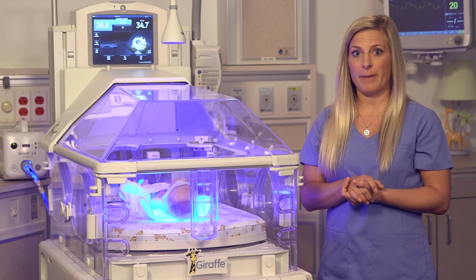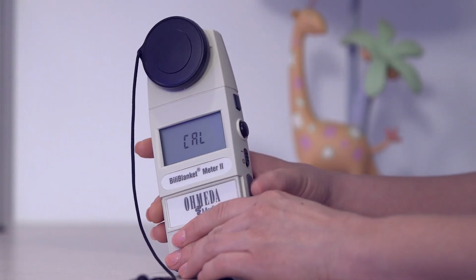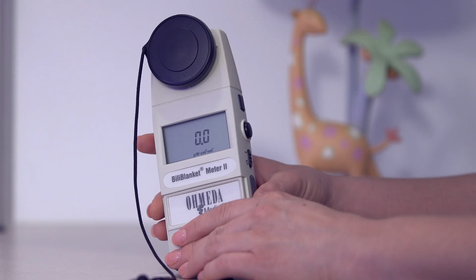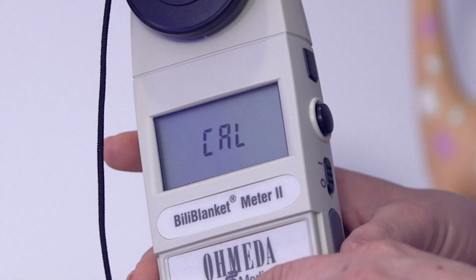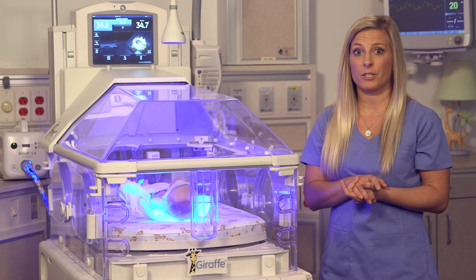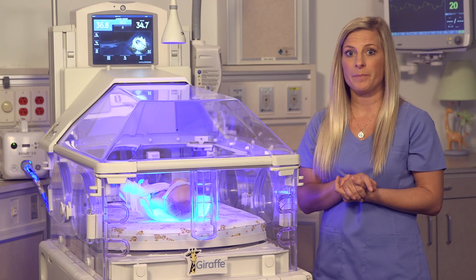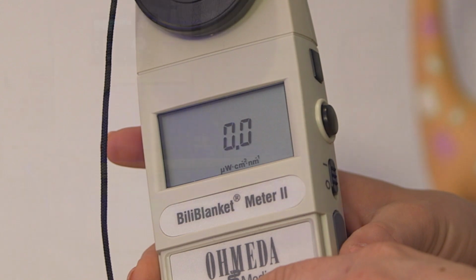We'll check to make sure the batteries work. Set the on-off switch to the on position. A zero adjustment is performed automatically when the switch is set to I or on. You'll see that Cal will be displayed during zero adjustment. Zero adjustment is performed electronically, so no cap is required. When zero adjustment is complete, the Cal message will disappear.